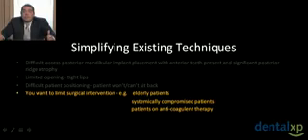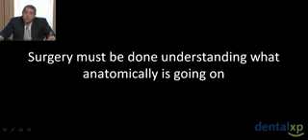So using computer guidance, we make the procedure shorter, quicker, more efficient, and all of a sudden we can employ a lot of procedures and techniques for that patient simply by shortening the length of time it takes us to do that procedure. We also have many patients today on anticoagulant therapy. By limiting the surgical intervention, we can now provide implant therapy for them, where before we may have been concerned about the bleeding because of the limitation of taking the patients off that anticoagulant therapy.